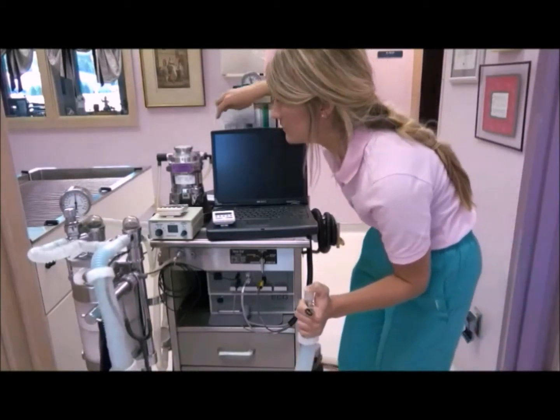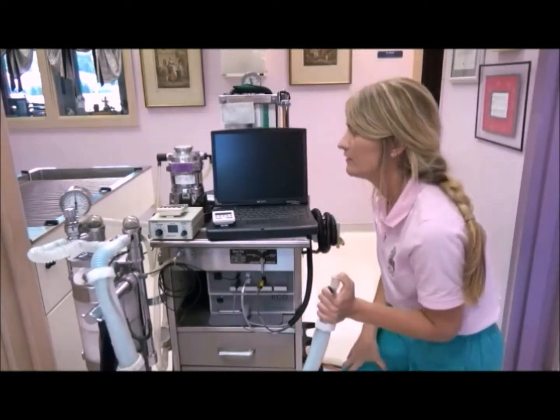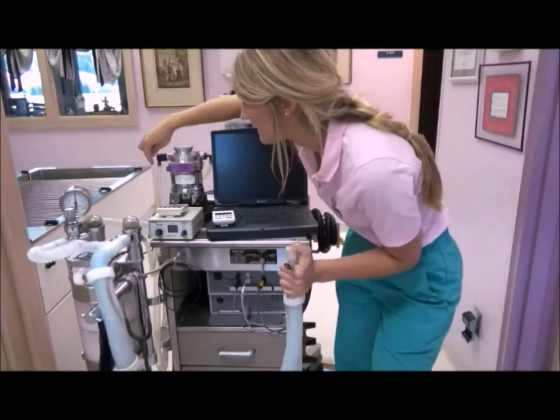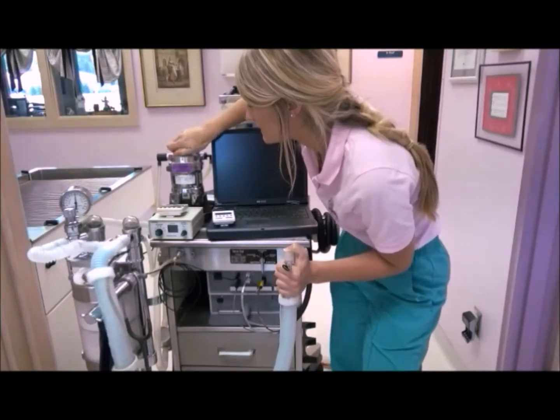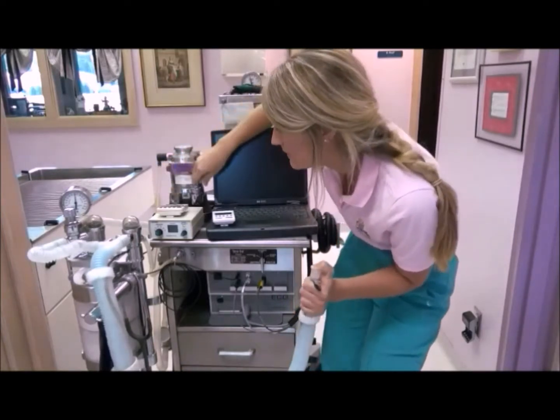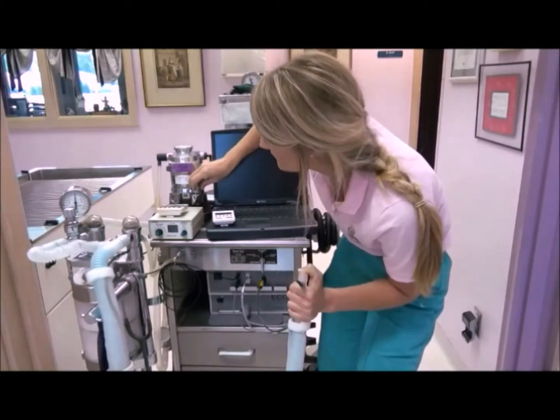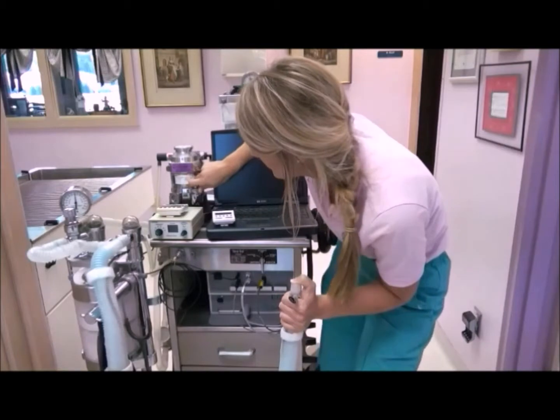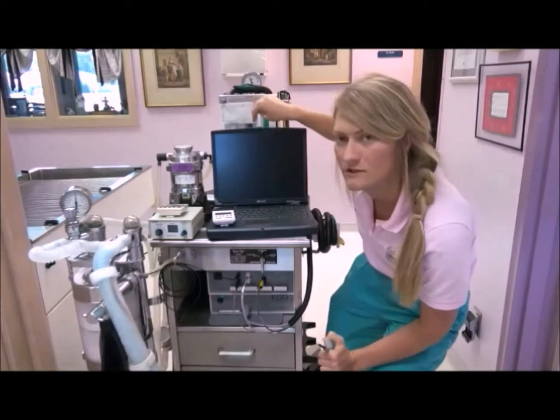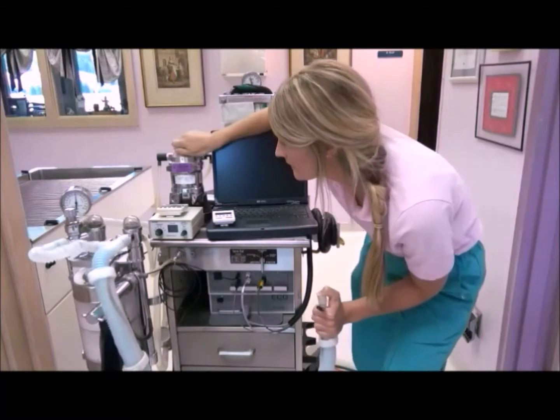And then from there, the oxygen travels to our precision vaporizer here. And we have an isoflurane precision vaporizer, as you can tell by the purple color. So once the oxygen comes in, you turn on your vaporizer. You always have to make sure that the isoflurane is to the full level. If it's not, you want to fill it up, and you would carefully pour the isoflurane into this reservoir there. But your isoflurane is only going to work if you have carrier gas present. So if your oxygen is not on, or if your oxygen tank is out, then the patient is not going to get any of the anesthetic.